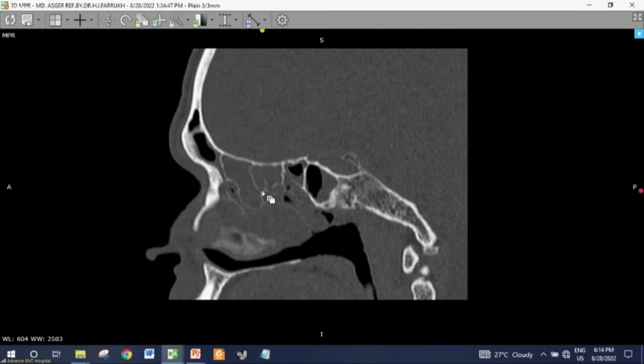So this is something interesting wherein a cell from behind is narrowing the frontal outflow and should be dealt with differently. As we know now from the sagittal, we can't afford to avulse this cell or go behind it. This has to be opened from front, and then the septation should be flushed with the posterior wall of the skull base.